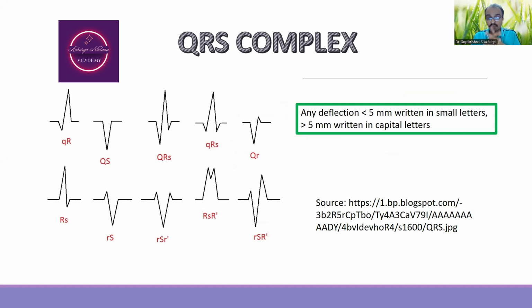The patterns are QR pattern, QS complex, QRS, with Q and R capital waves, Q small, R capital and S small, Q capital and R small wave, R capital and S wave, R small and S capital wave, and RS and R dash wave.